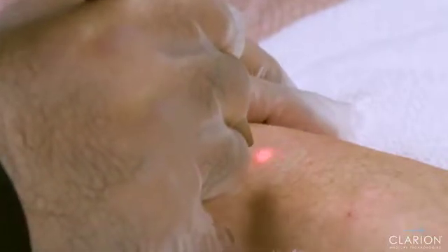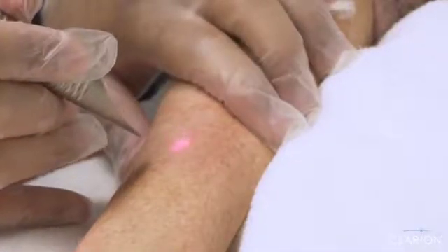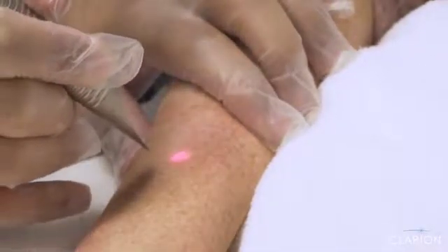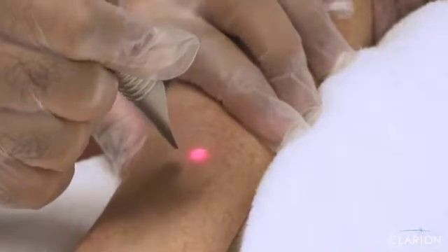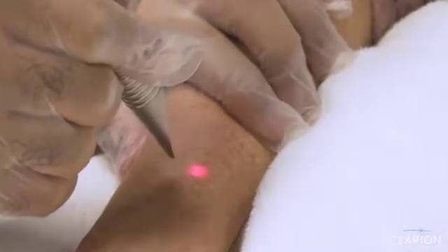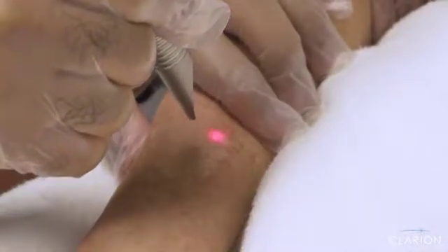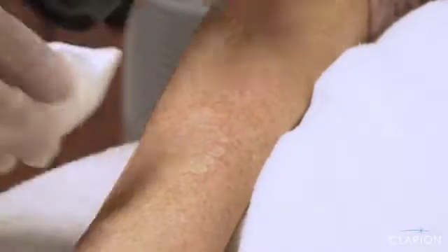Here I can be a little bit more selective on the areas of pigments. I don't need to go everywhere. Almost done. Okay.